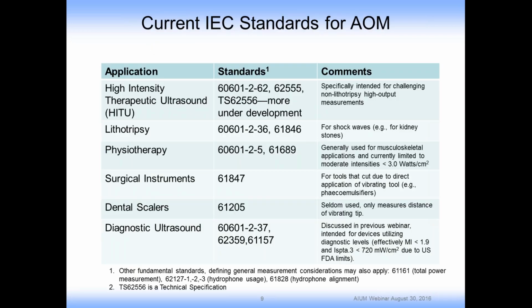So given that, I wanted to briefly review what are the current IEC standards that cover acoustic output measurement. First of all, and most recent, we have standards for high-intensity therapeutic ultrasound, or HITU. I'll mention that HIFU is part of this. It's just that when we were developing the standards, we realized that there were some applications that did not involve focusing, which is what HIFU stands for. HIFU stands for high-intensity focused ultrasound. So to make this standard more inclusive, it was designated as HITU.